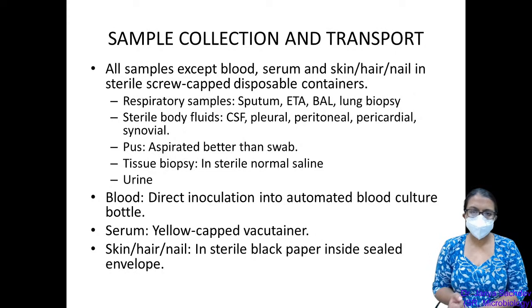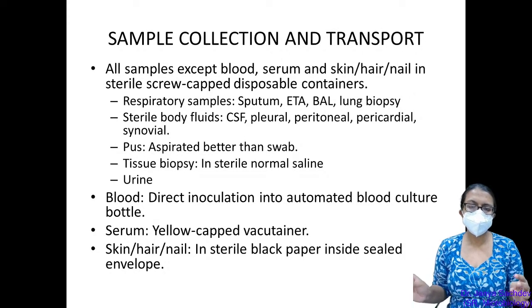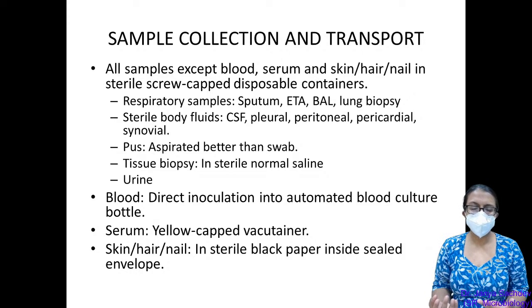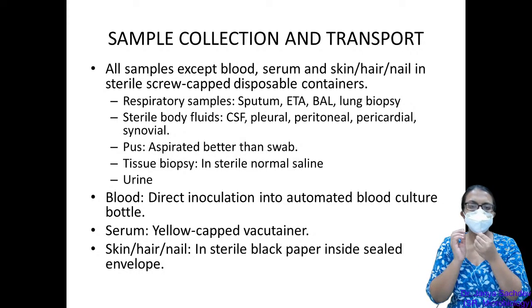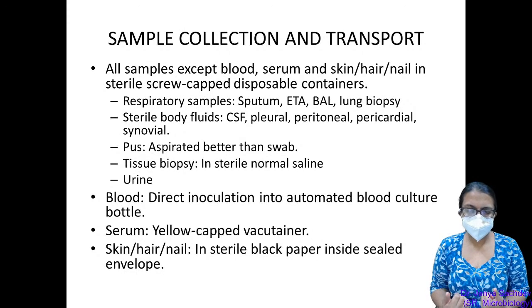We receive respiratory samples, we receive sterile body fluids, we receive pus, biopsies, urine, blood. We receive serum for serological assays, skin, hair, and nails. So we receive a very wide variety of samples in the mycology laboratory. And the sample collection and transport is very important because the quality of the report and the information we're able to provide will depend on the quality of the sample that is provided to us.